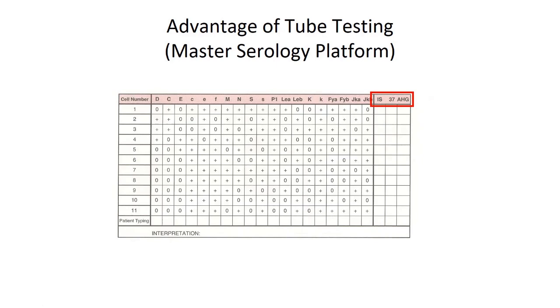So this is essentially showing what you might need to be subtracting for in your understanding of your anti-human globulin reaction. But finally, your anti-human globulin reaction is your 37-degree incubation with your anti-human globulin to determine truly whether or not there are IgGs involved. And these are the more clinically significant in vivo antibodies when it comes to the protein-based systems that these antibodies are targeting.